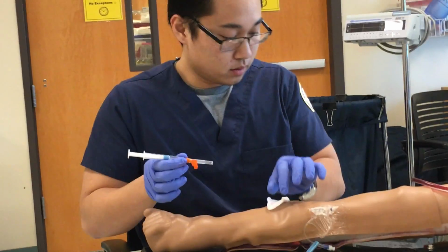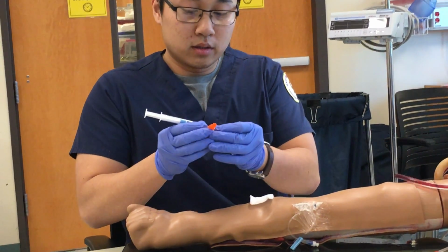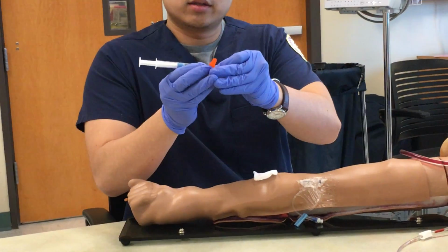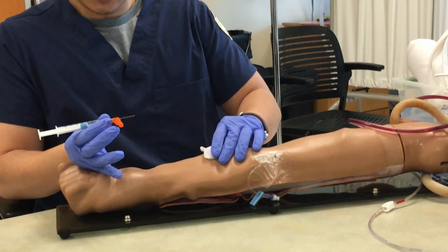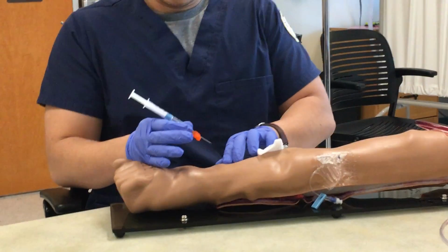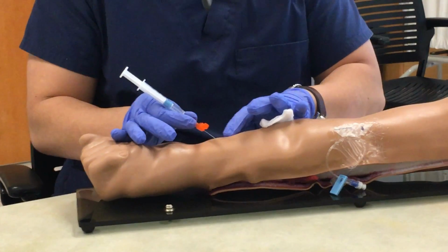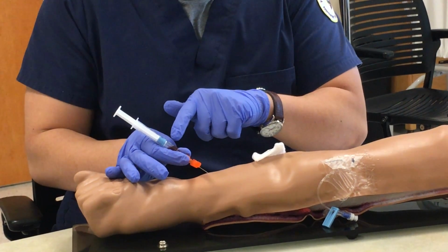Alright, now that everything's all prepared, I'm going to prepare this cap right here, take off the cap from the needle, hyperextend the wrist, and come in at a 45-degree angle. Alright, and now I'm going to stick the patient, and I can tell I hit an artery since it flashed and it's filling relatively quickly.